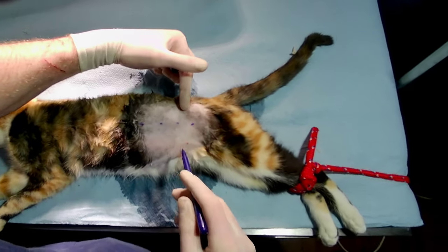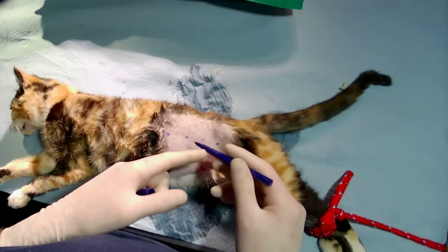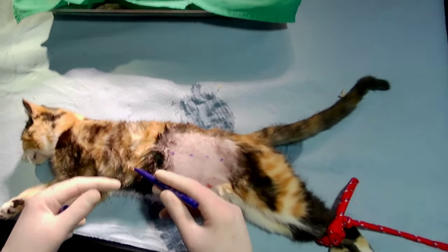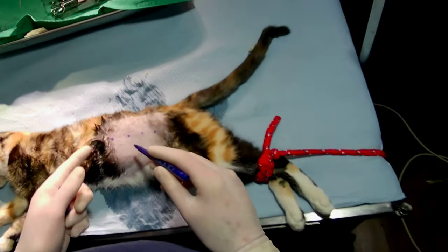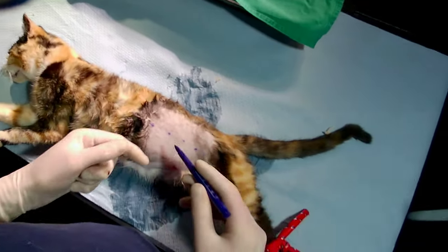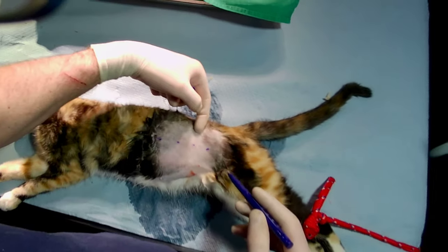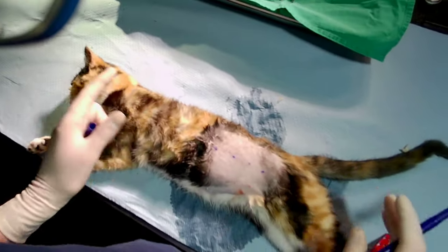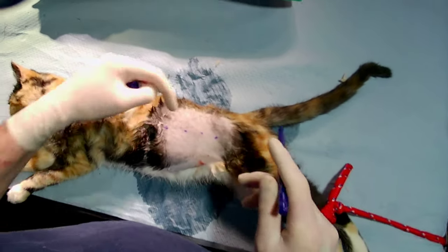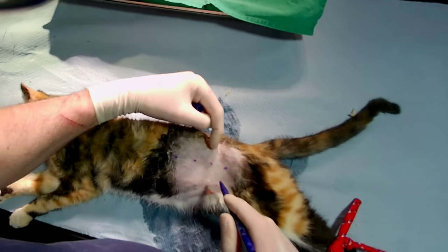Regarding where we go cranially or caudally, it depends on the cat. The more cranial we go, the easier it is for the ovaries but the harder it is to get the uterine bifurcation. Too far caudal makes the ovaries harder. For a large cat I go a finger in front of the pelvis; for a medium-sized cat about half a finger; and for a really small one just slightly in front of the pelvis.